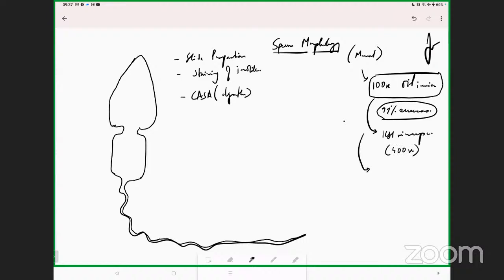You want to go one step ahead, you can use the IMSI lens, and IMSI is basically a software, which allows you approximately 6,600 times. But I have the IMSI, and I will tell you that for a routine purpose, it is absolutely a waste.